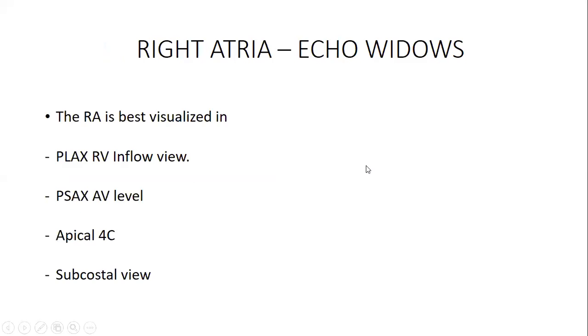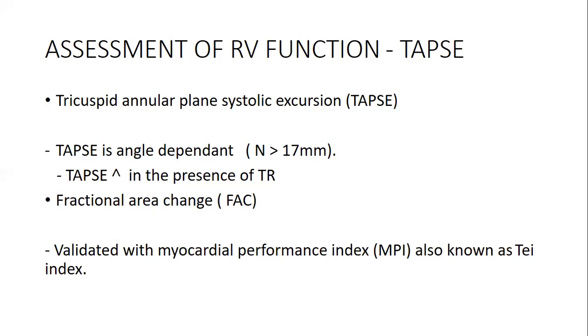So this is how you do, oh, sorry. Sorry, the image was not uploaded. Sorry for that. But I think I'll show you there's an image on TAPSE on how to measure.